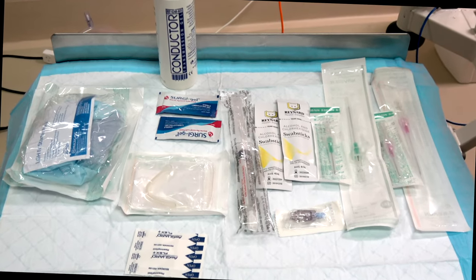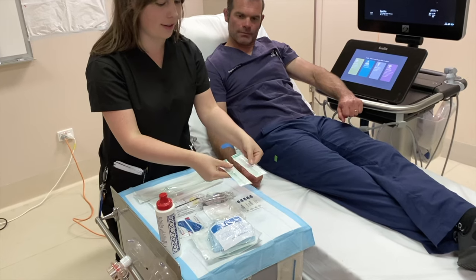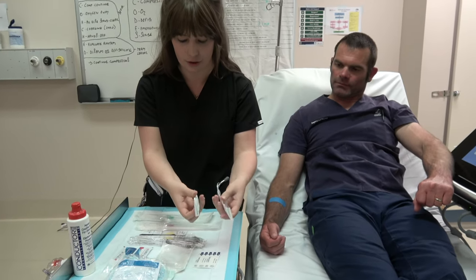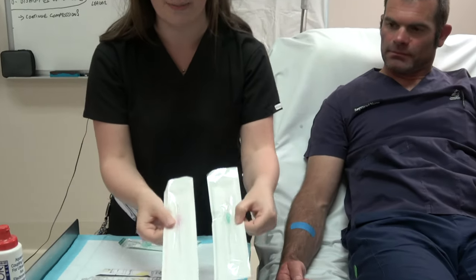This is a typical array of the equipment you will be required to use. Generally, a longer cannula is required. 18 or 20 gauge is commonly used.